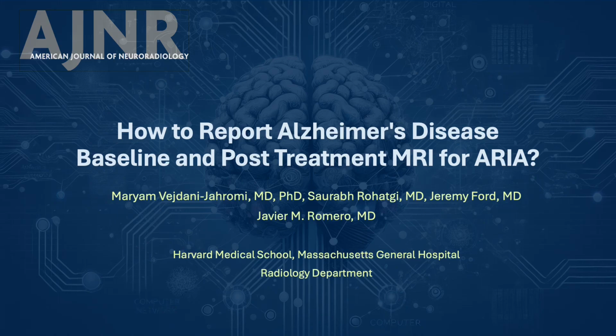In this short presentation for AJNR Trainees Corner, we are going to talk about how to report Alzheimer's disease baseline and post-treatment MRI for ARIA, what imaging features to look for, and what details to include in your reports.